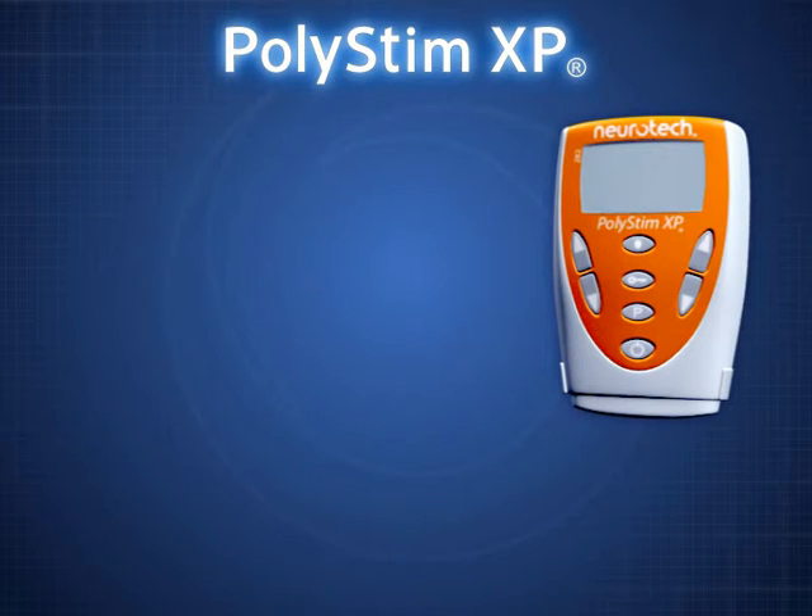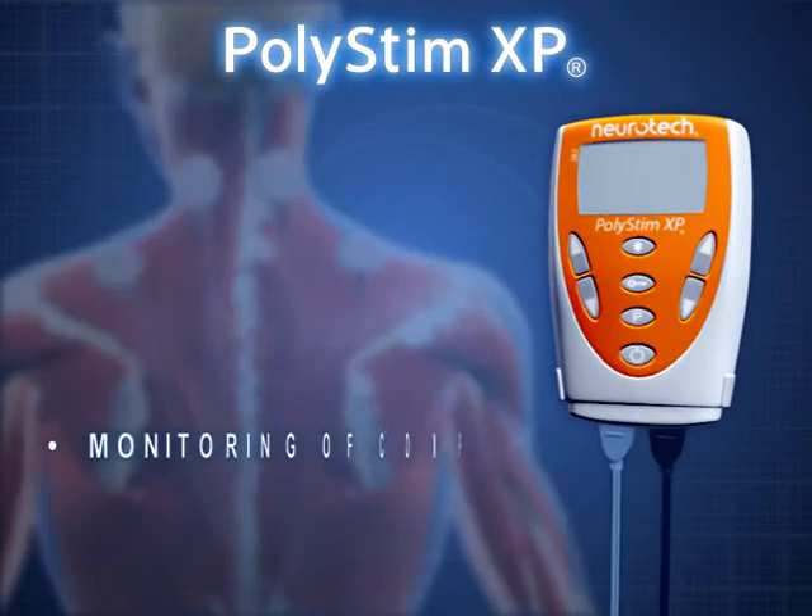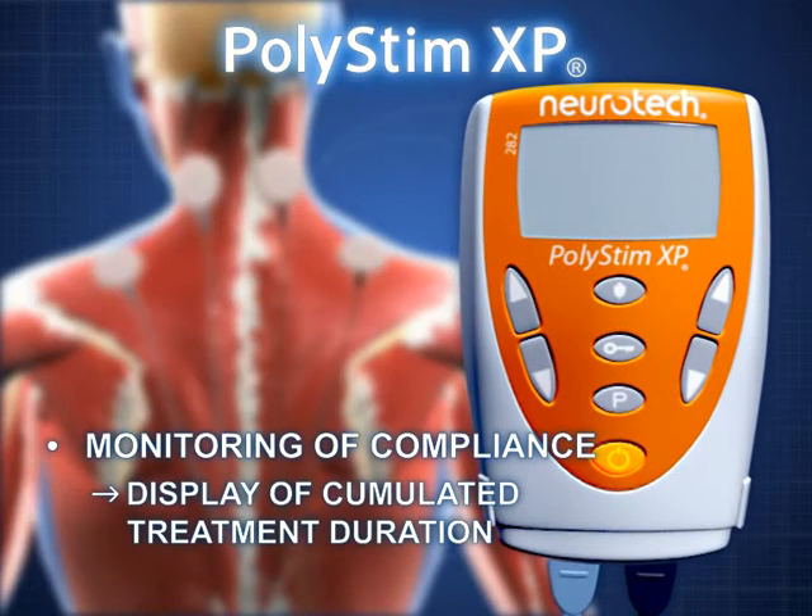The Polystim XP records treatment sessions. The accumulated duration of treatment is displayed after the device is switched on. This monitoring instrument makes it quick and easy to check on patient compliance.